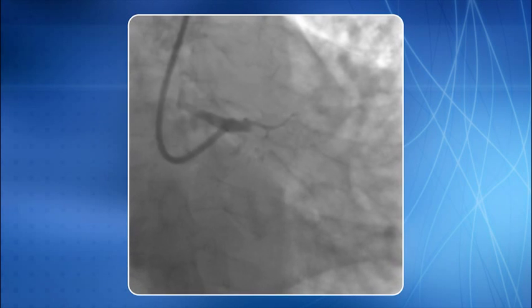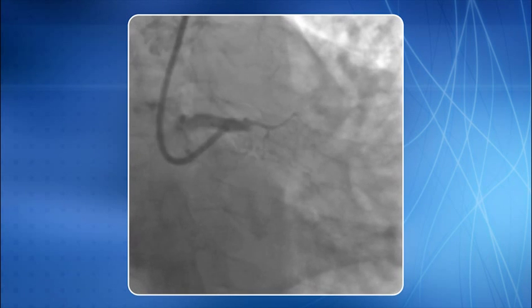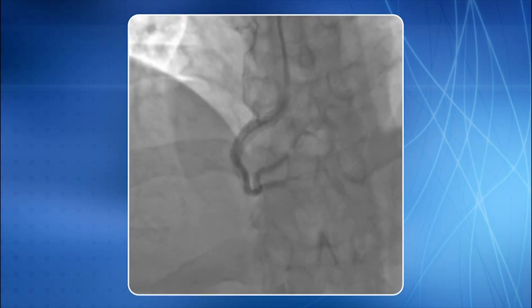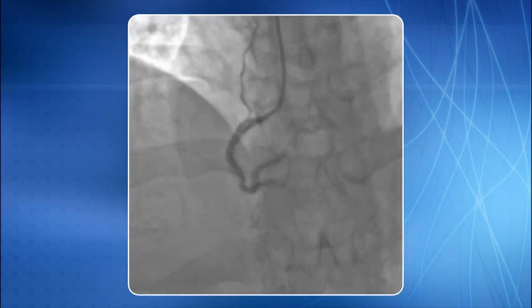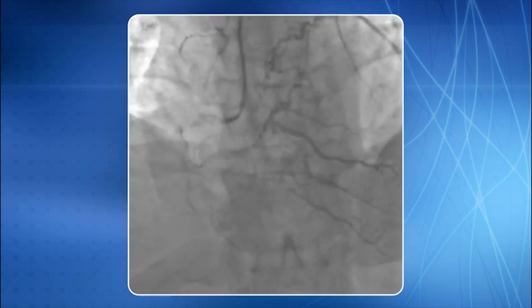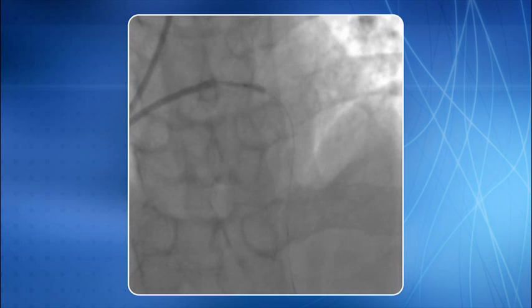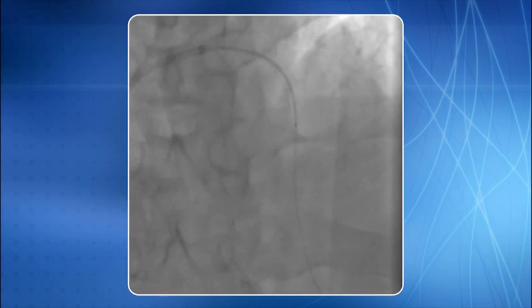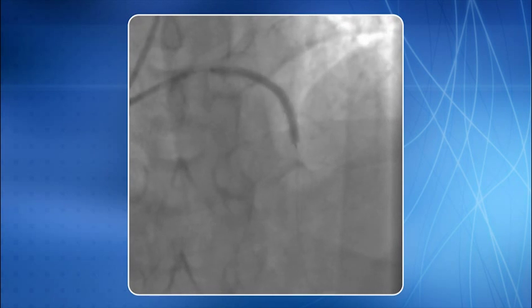Selective LMCA injection through a 6F EBU 3.5 guide catheter reveals a total occlusion of the LMCA with a large thrombus. An RCA injection reveals retrograde filling of the LCA. A 0.014 inch BMW PTCA guide wire was deployed and PTCA was performed. The stent was positioned and then deployed.